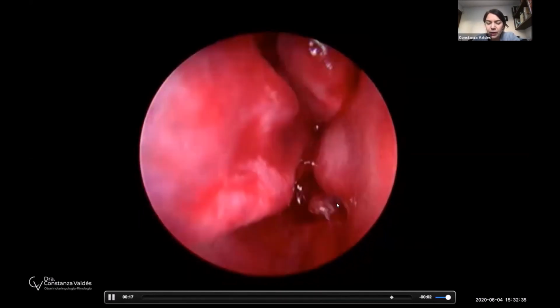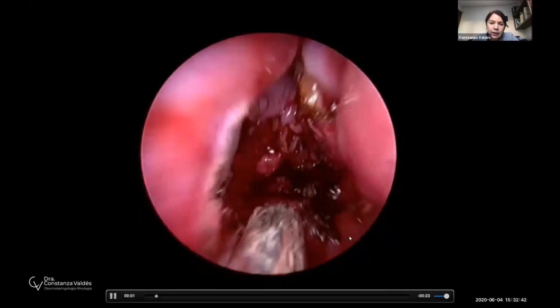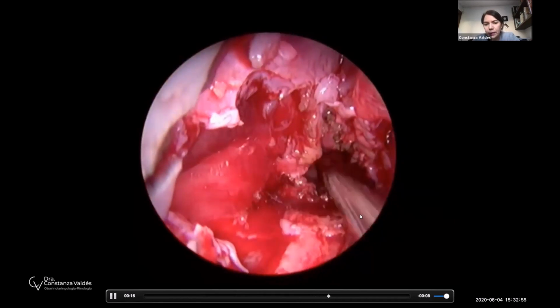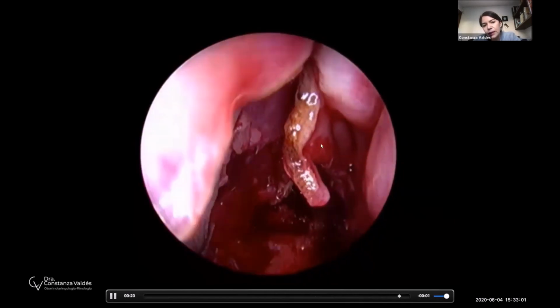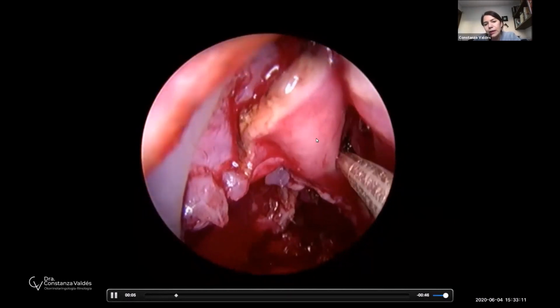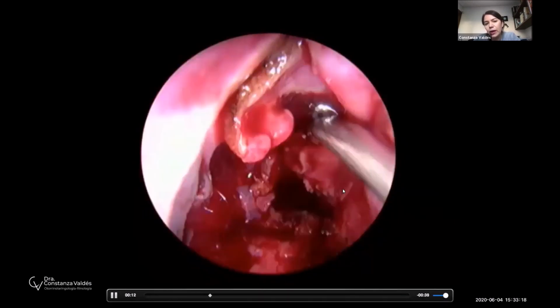And it's important when you cut this part of the septum also to cauterize it so the patient doesn't bleed afterwards. And at the end of the surgery, you would see the superior flaps. It's not seen well. And the lateral flaps, and a quite good aperture over there. And it's important to revise this flap. You can see now this flap is too big, so I'm going to cut it so it fits perfectly inside the nose and doesn't come back and come down. So usually all these lateral flaps are bigger, and you usually have to cut them and position them so it covers all the raw area.